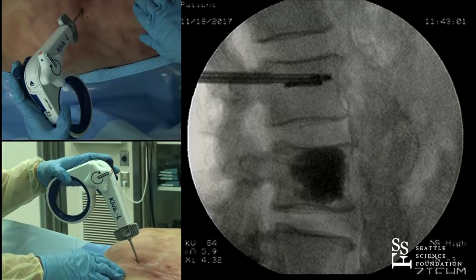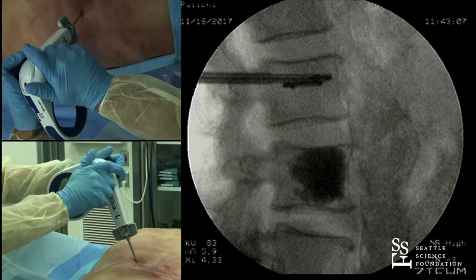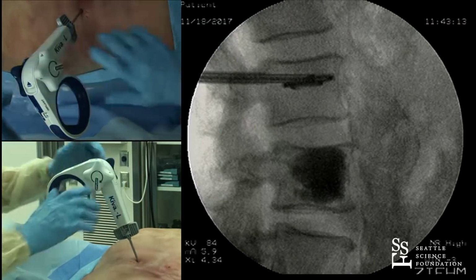All right, so we have a pretty frozen cadaver, and that's maybe about as much of a deployment as we're going to get out of this. Let's check an AP, please. And if we do, that's no problem.